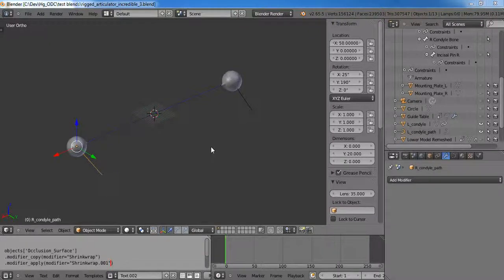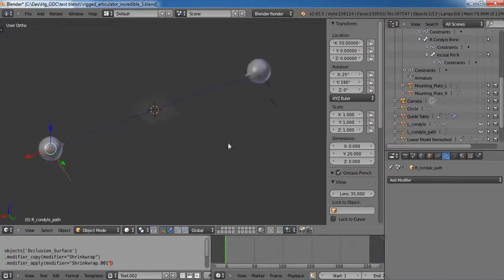Okay, now this relatively unimpressive scene that you're looking at is my first attempt at reproducing a digital, is probably the wrong word, but virtual articulator. Here I have condyles. These two little straight lines represent our condylar path. Later I'll show you some teeth or some custom incisal guide tables so that we get some semblance of an occlusion, and then the muscles of mastication are our hands, just like they are in a physical articulator.